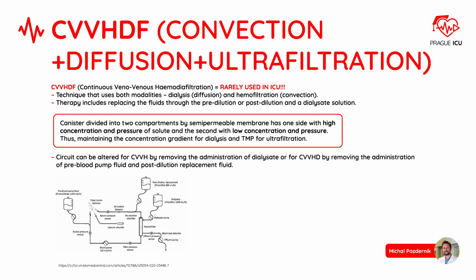CVVHDF, continuous veno-venous hemodiafiltration, is rarely used in ICU nowadays. It works on the basis of convection, diffusion, and ultrafiltration. This technique uses both modalities, dialysis with diffusion and hemofiltration using convection. This therapy includes replacing the fluids through the pre-dilution or post-dilution and the dialysate solution.